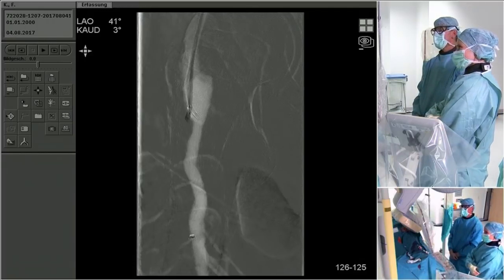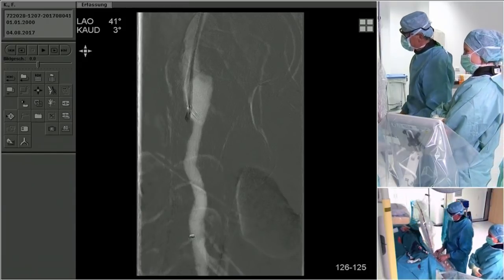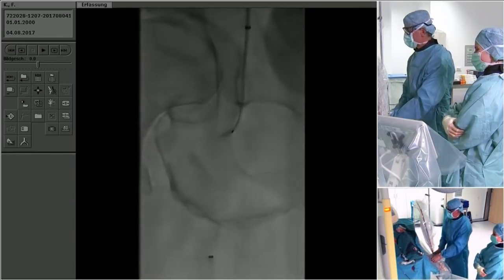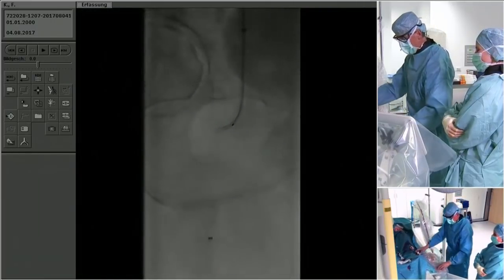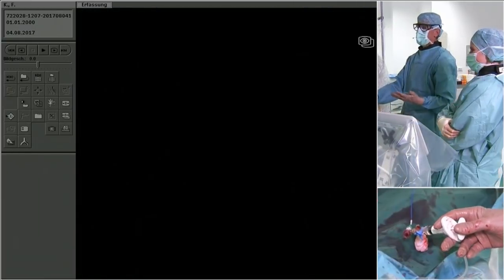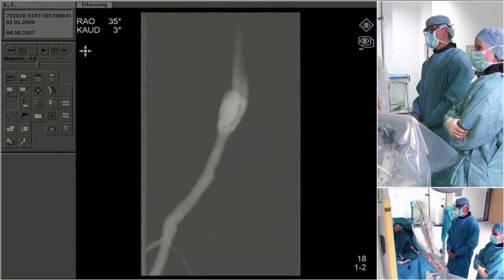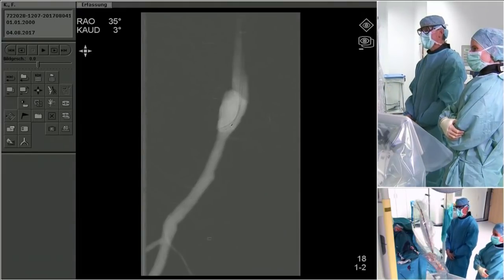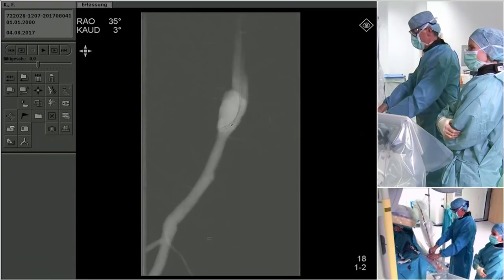Andrej, in such situations, have you ever used an ultrasound catheter probe on the skin to tell you where the proximal superficial femoral artery could be? Yeah. Yes, I found it very cumbersome, and actually rather use this catheter target technique. We need to go a little bit higher. Yes. Although I think if the artery is cut off, why not try to get there? Not in this angulation, but at least in this angulation here.